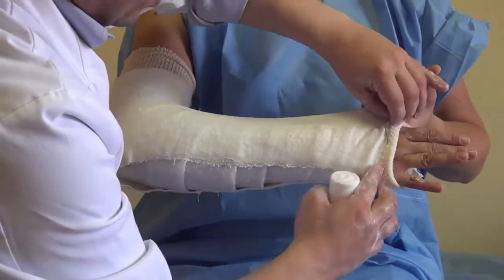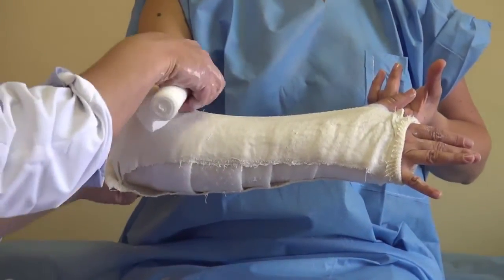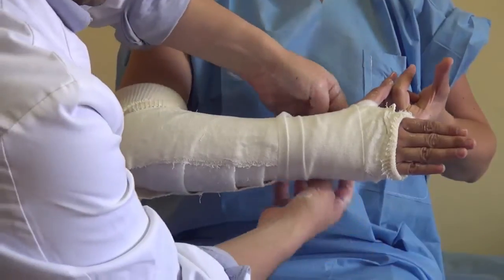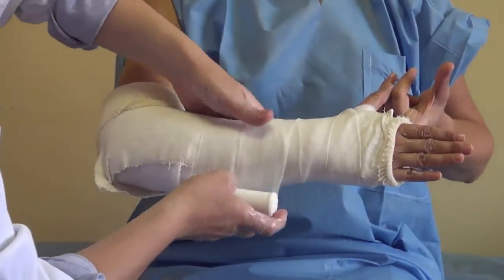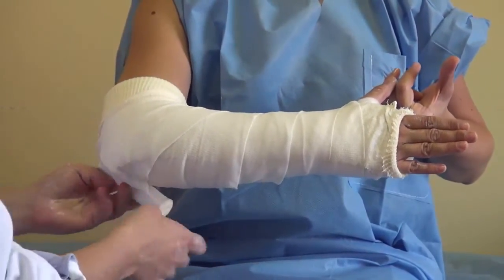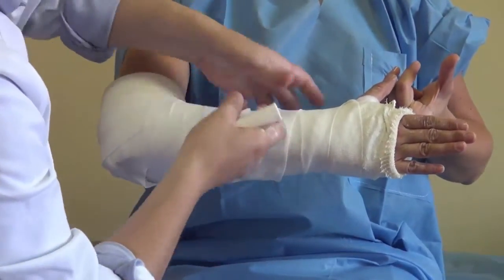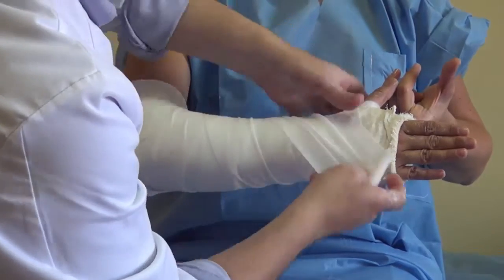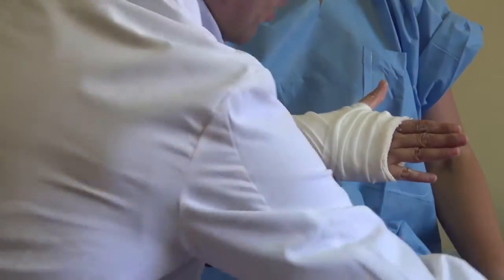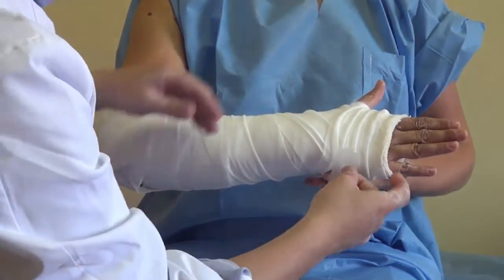You can fold the border of the cast over to protect the fingers, up and down. Then, with another layer, you go around with gauze to get everything together in order to make the construct more stable. It doesn't have to be very tight, and it's already done.